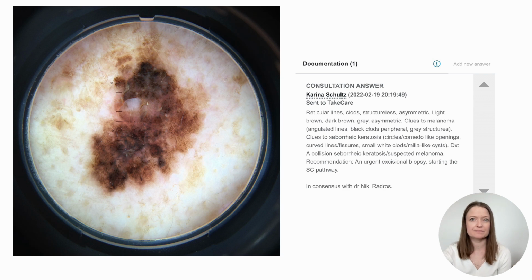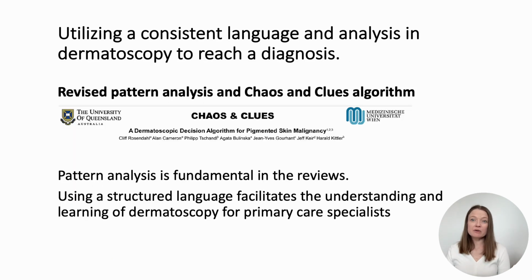We have noticed that primary care specialists in a relatively short time are shifting towards more difficult cases, which indicates a rapid learning curve. In every case, a detailed answer is written using pattern analysis as a framework. Primary care specialists acquire training in dermoscopy in structured response forms during their daily clinical practice.